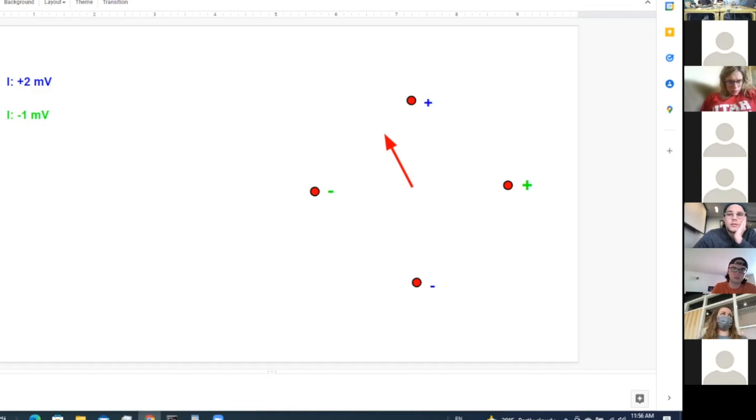The way that we use the third dimension clinically is by using precordial leads. So we're talking about leads that are essentially Einthoven's triangle, like these leads, but precordials come across this direction, and there's also posterior leads that you can use, and those can help clarify localizations of different infarctions and stuff like that.